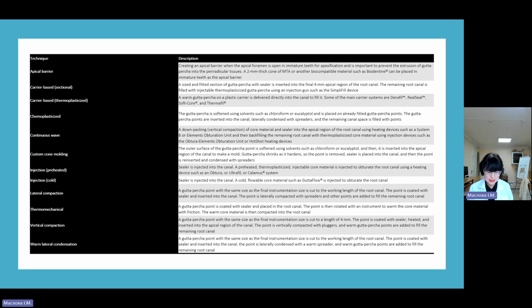ProRoot Endo Sealer was introduced in 2016. The main powder compounds are tricalcium silicate and dicalcium silicate, with calcium sulfate included as a setting retardant. Bismuth oxide is a radiopacifier, and there is a small amount of tricalcium aluminate. They are the same components found in other sealers, but it is not grouped with the type 2 HCSC sealers.